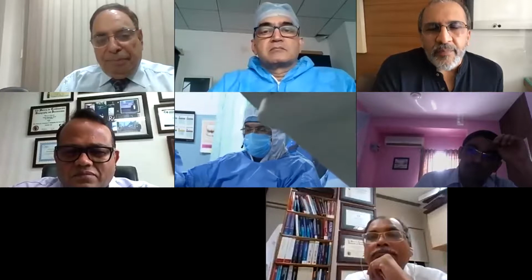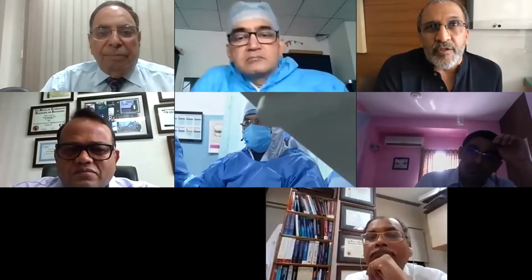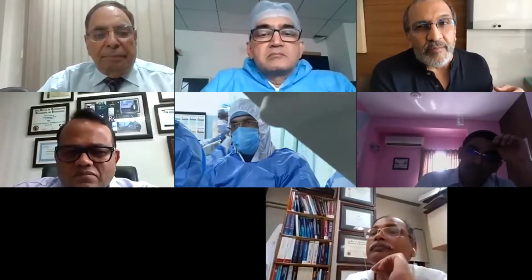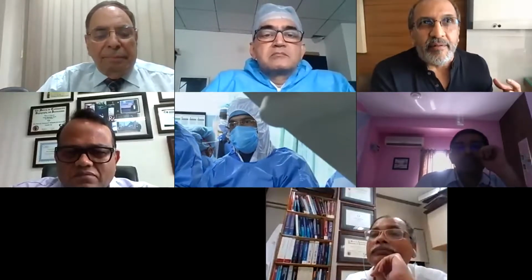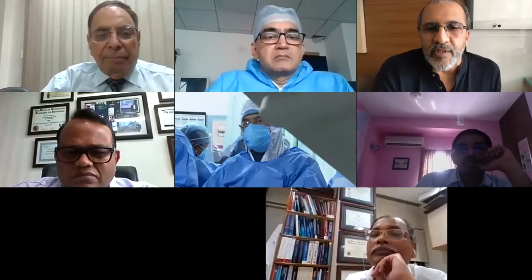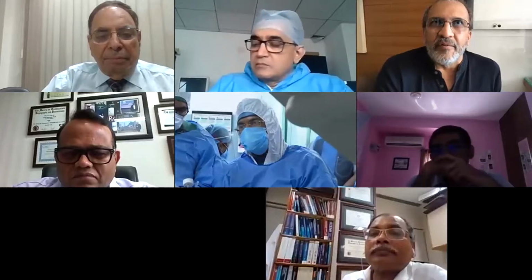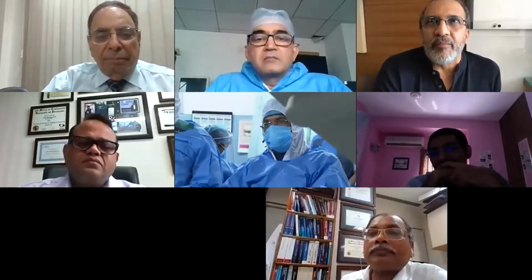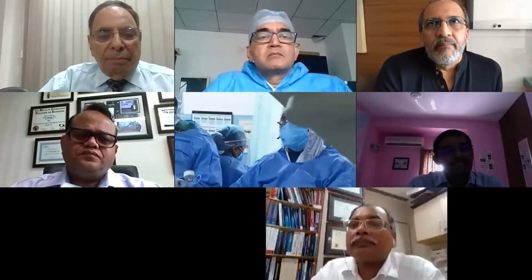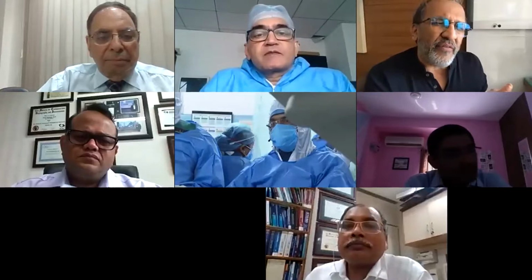I typically, for these patients, would take an 8 French guiding catheter unless there is a specific issue where we started off thinking that, okay, we'll just treat two of these arteries, but you end up eventually wanting to treat the third. It is very easy to put in a second guiding catheter and assist in the entire procedure. You've got to remember that when you have two guiding catheters, it is more equipment to worry about. And the more the equipment, the more likely you're getting into trouble. I think keeping it simple is the key. And even in trifurcations, true trifurcations are very few.